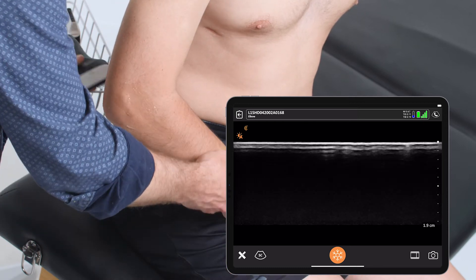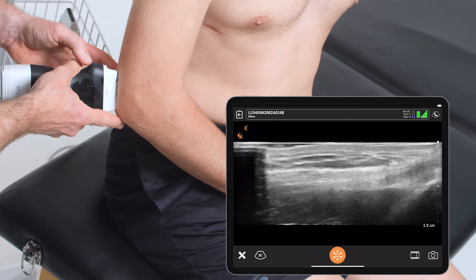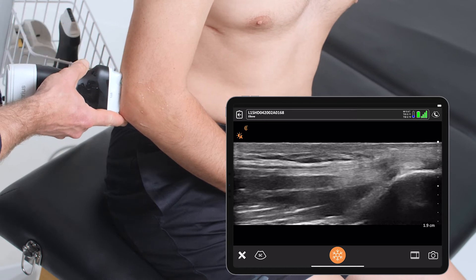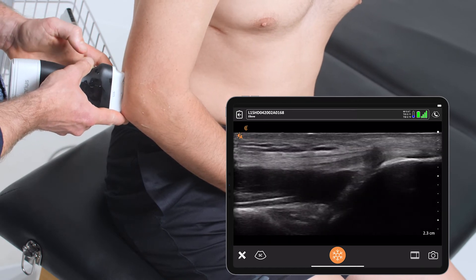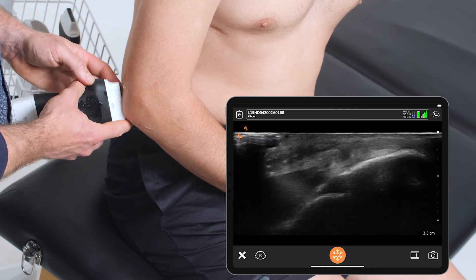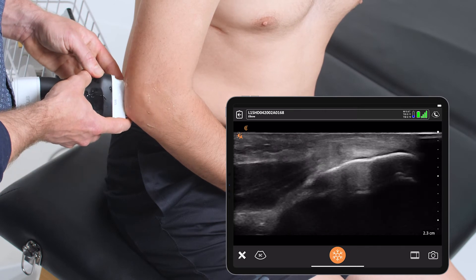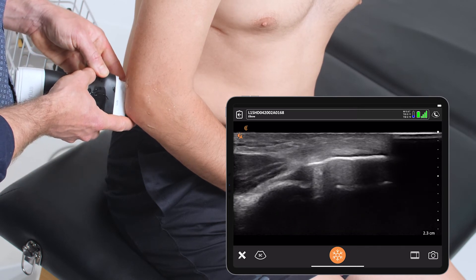Finally, I'll finish my scan on the posterior aspect, looking at the triceps insertion here above the humerus and down into the olecranon, looking for any signs of olecranon bursitis, which here, in a normal patient, really only shows up as a potential space.